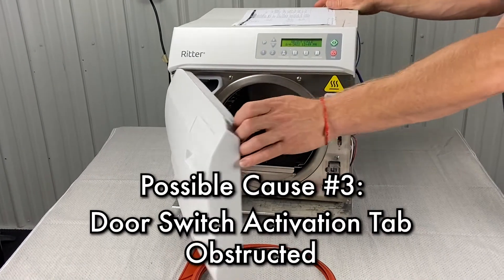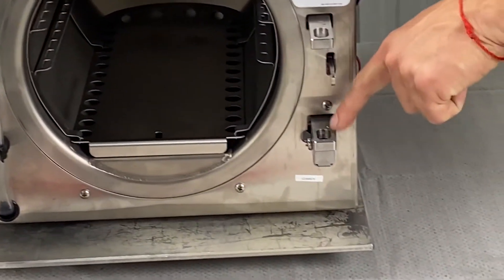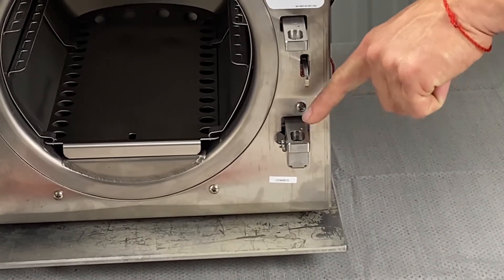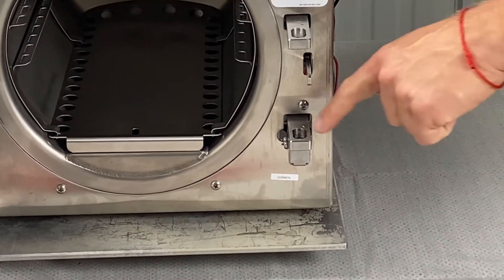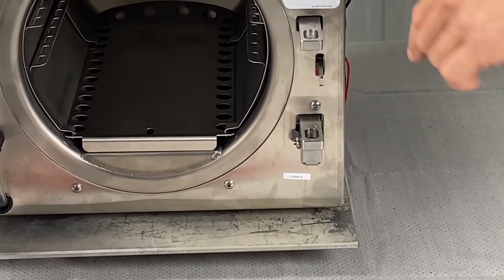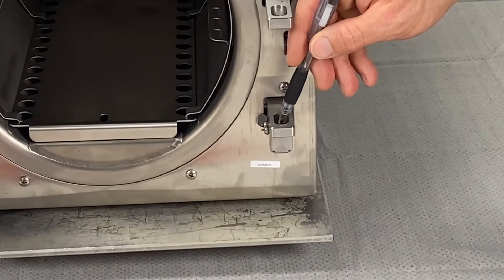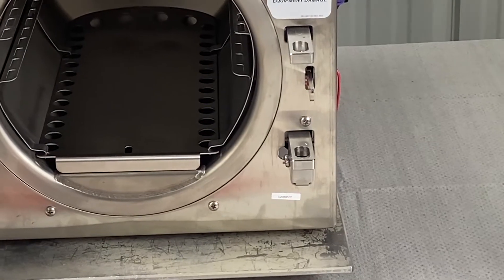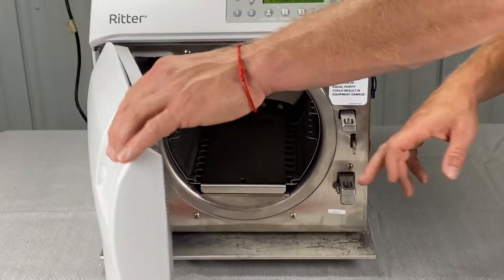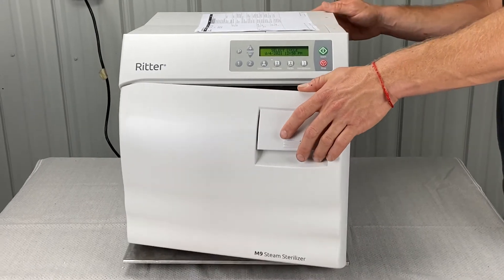The next thing is the door switch activation tab being obstructed. The door switch activation tab is in here — sometimes they even break off. Push down on it and make sure it clicks. If it clicks, it usually works. If the tab's not there and you don't see anything to push down on, then it could be bad — that could be the issue.